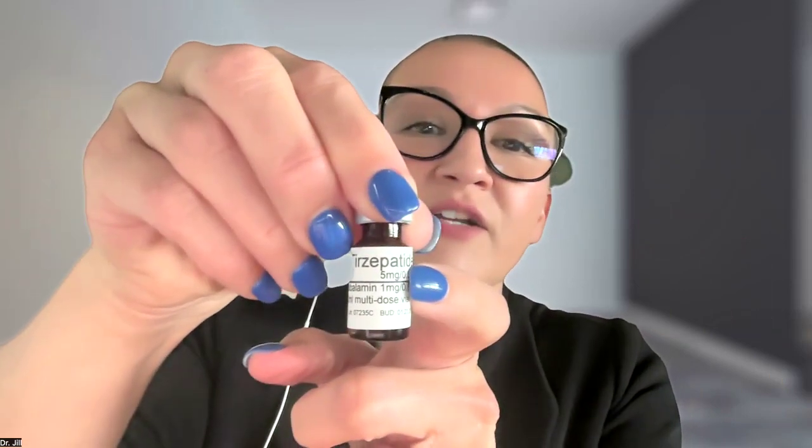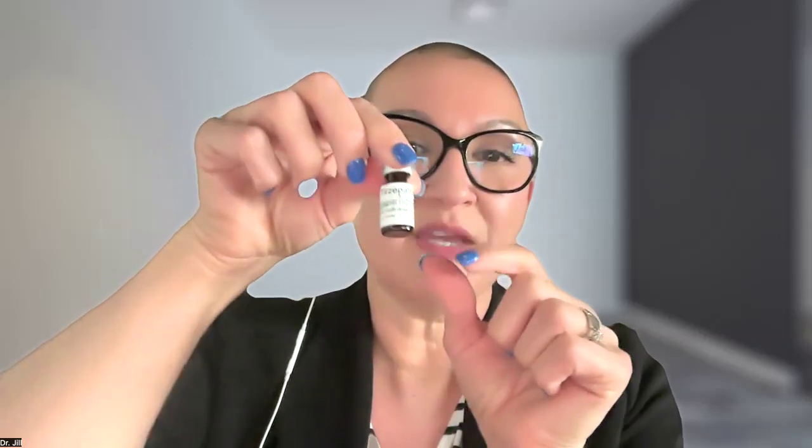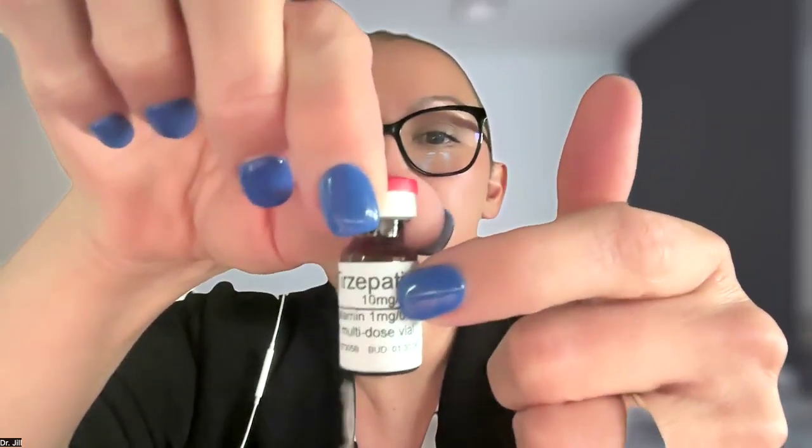Now, if you have multiple vials and they're different strengths, you want to make sure you're using the strength that says this is month 1, and it does say, which not to confuse the situation, but this is my month 2, and so my month 2 says 5 milligrams right there. Okay, there's my 5 milligrams. So this is my 5 milligram per 50 units. Well, here's next month's. Oh no, this is 2 months from now. Sorry. This is my 10 milligrams.